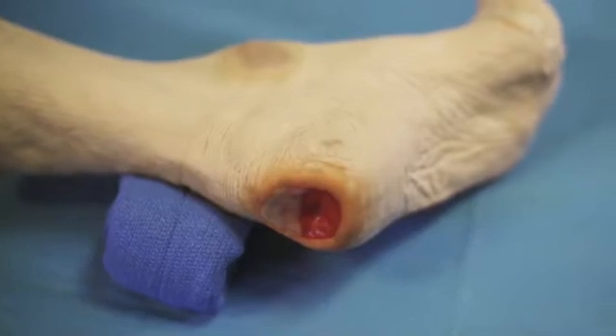Hello, I'm Chris Shuttle, Certified Wound Care and Hyperbaric Specialist. In this video, I'll be demonstrating how to apply the VAC Therapy System dressing on a foot wound using the bridge technique.